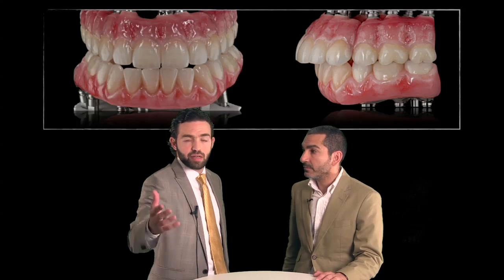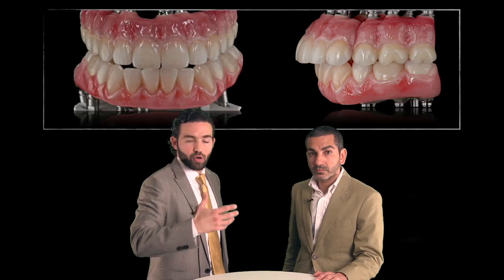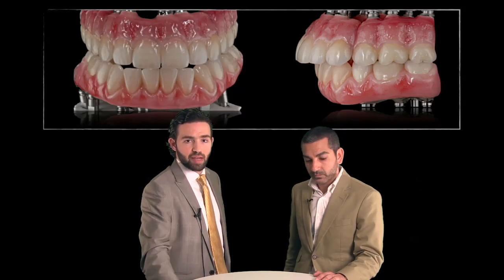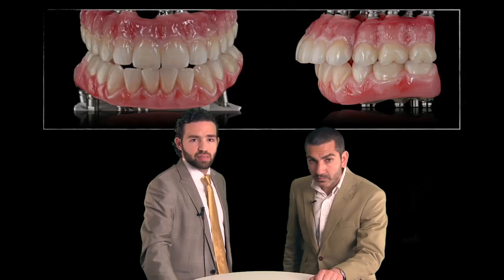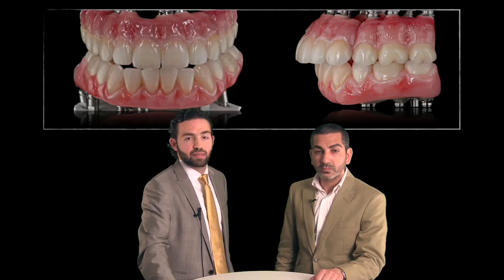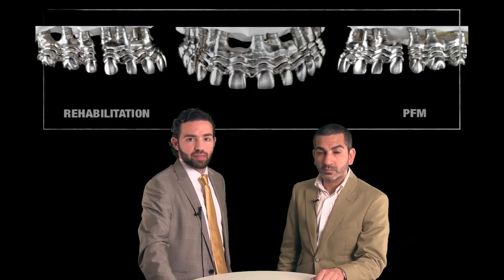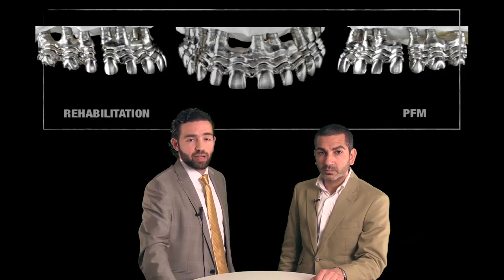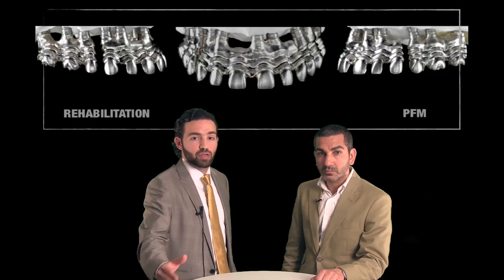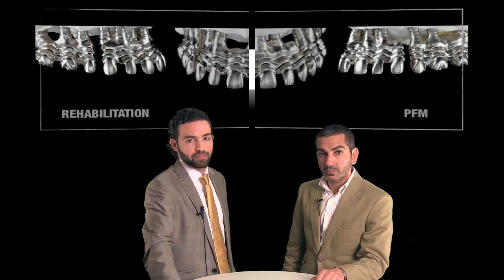Knowledge and skill are combined to be able to deliver beautiful restorations. Yes. And you see here in this picture, the maxilla is done by all porcelain fused to metal. The implants are splinted for better biomechanics, and really the aesthetic results and the functional results and the long term of it is very, very predictable. And we see here the rehabilitation, and with the metal framework, yes, as we said earlier, it's a bit costly, but in the long run, it is the best service that you can provide for your patients.